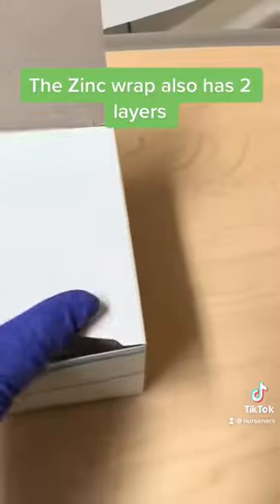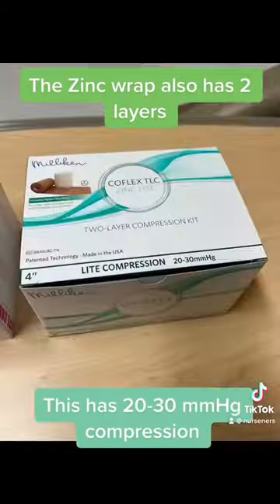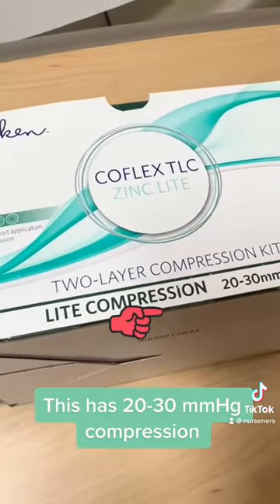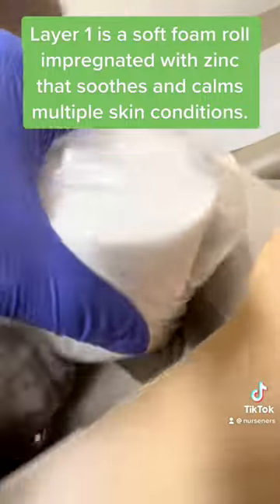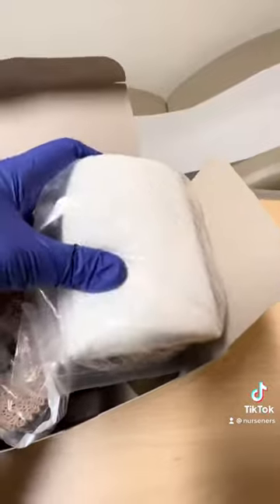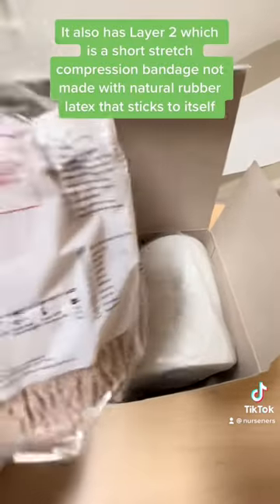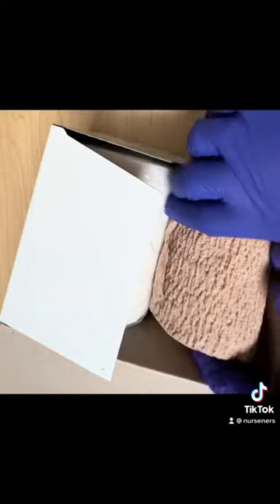The Zinc wrap also has two layers, with 20 to 30 mmHg compression. Layer one is a soft foam roll impregnated with zinc that soothes and calms multiple skin conditions. It also has a layer two, which is a short stretch compression bandage not made with natural rubber latex that sticks to itself.